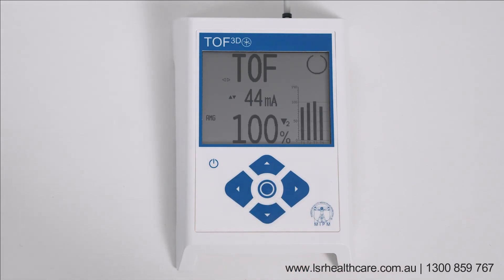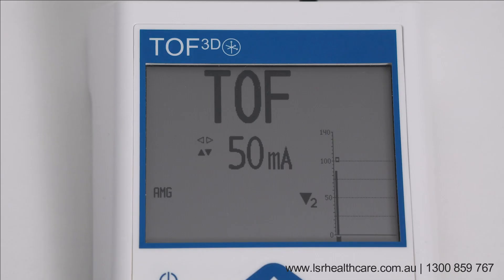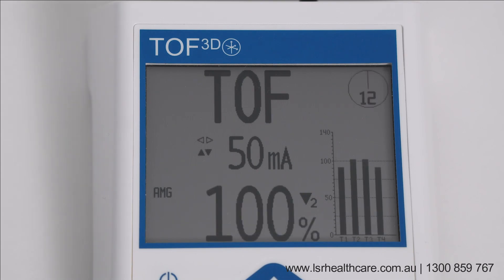Initiate a single TOF measurement by pressing the center key shortly. Start continuous TOF measurement by pressing the center key for one second. TOF ratio and TOF count are displayed in the main screen. On the right side, you can observe the twitch response and trend. In continuous TOF mode, the monitor starts a measurement every 12 seconds.